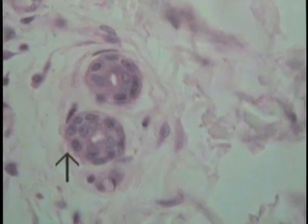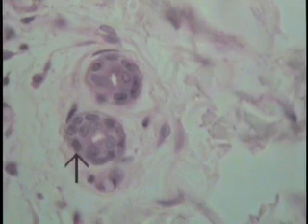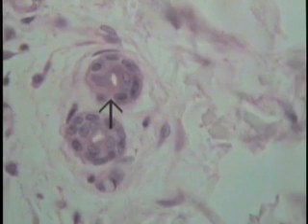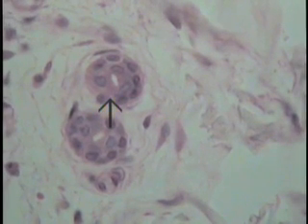So there are two layers of cells, the luminal most or the superficial most of which is cuboidal in shape, therefore it satisfies the definition of a stratified cuboidal type of epithelium. Another profile through this same duct is shown at the tip of the pointer. So this is a classic example of stratified cuboidal epithelium.